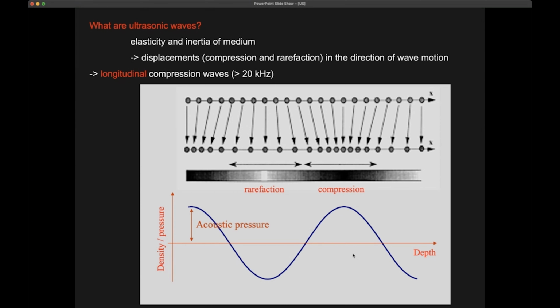But what is really important is that it's an alternating pressure. That means that you both compress it, but you of course also extend it. The amount of compression and extension can be somewhat similar, but you can already imagine that if you take tissue and locally extend it a lot, you have a chance that you do damage. And that's what is possible with ultrasound. We also use ultrasound for lithotripsy, which is trying to destroy, for example, stones in the kidneys or in the gallbladder. It's all based on the fact that locally you induce a compression and an extension, and this way you can either try to image the objects, or you can try to destroy the object, on purpose or not on purpose. So that's why this local pressure is quite important to understand.